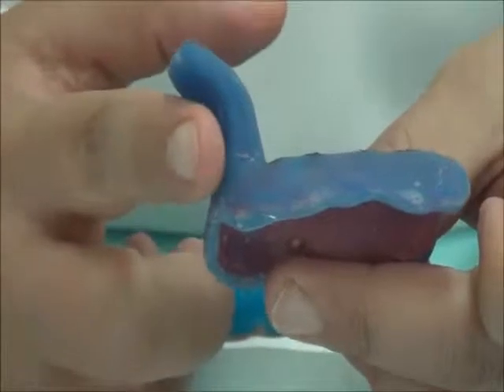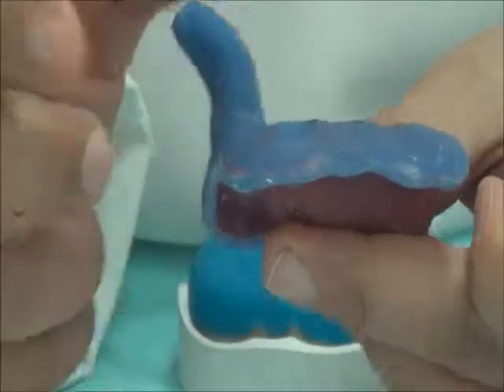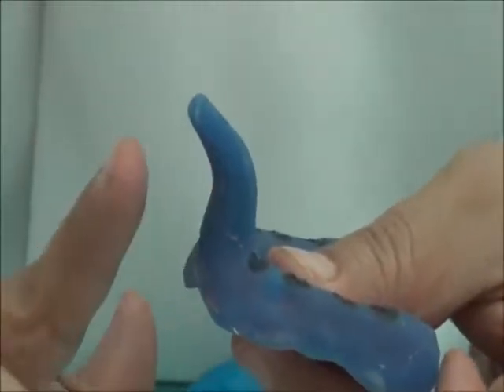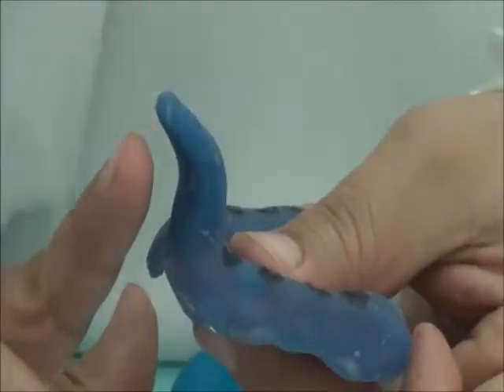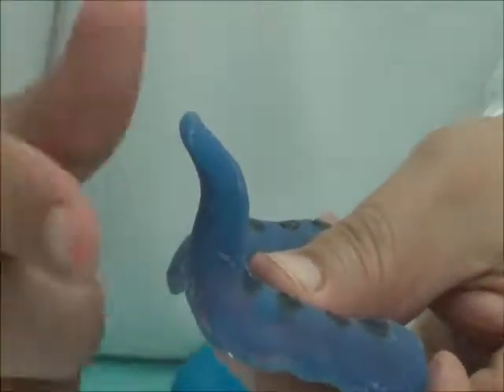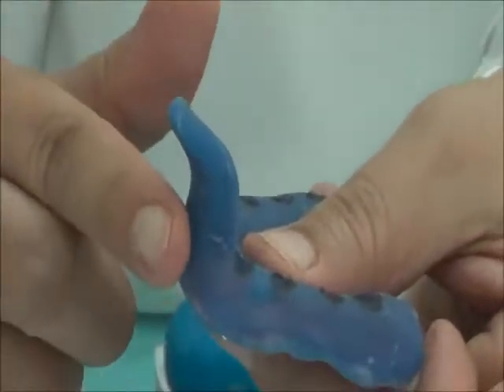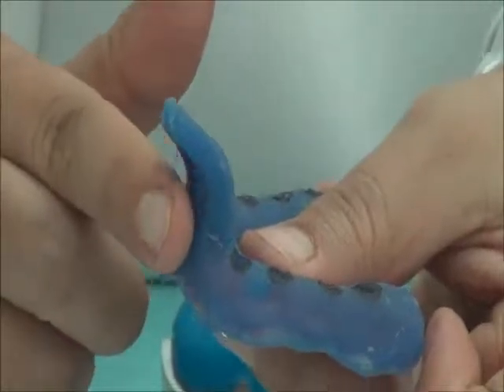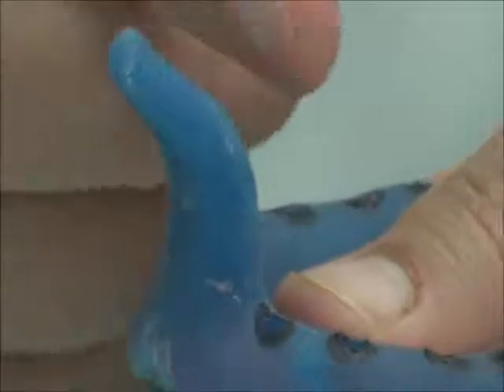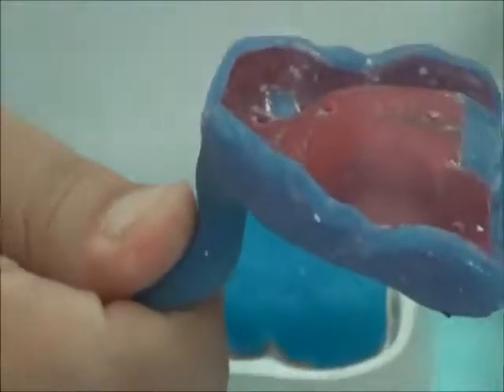We also need to make sure that the handle can accommodate the lip without distortion. If my handle is going to the outside, it will interfere with the lip of the patient. So we need to make sure that the handle is clear from the lip by making the first part of it vertical, and then we rotate it to the outside just enough to make a grip while holding and taking the impression.